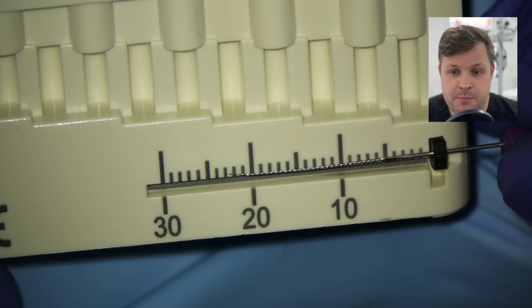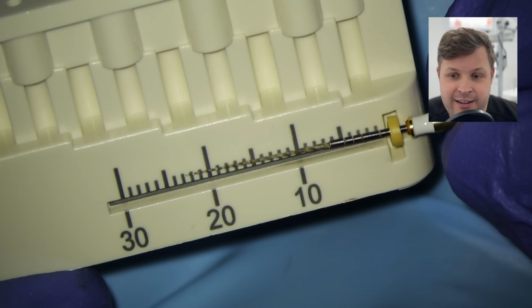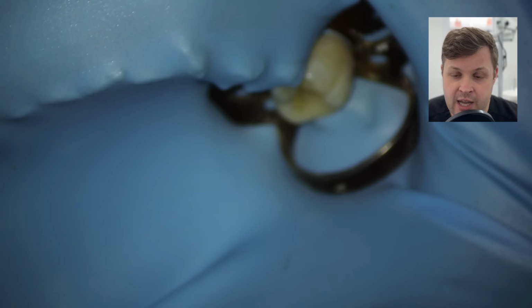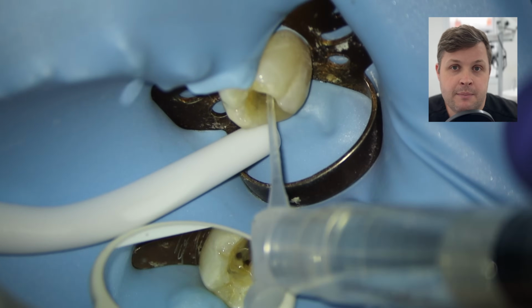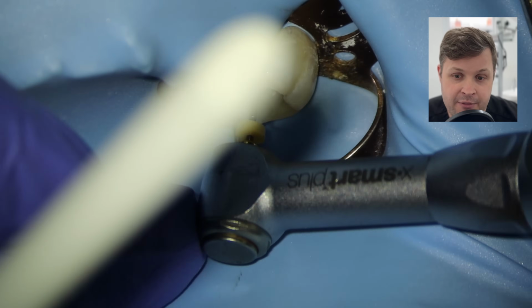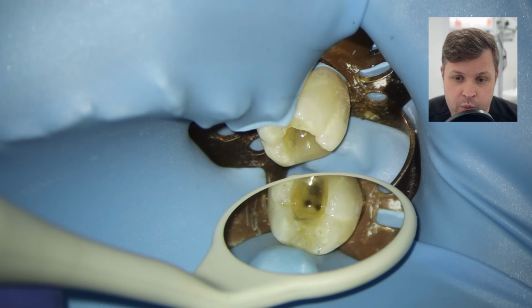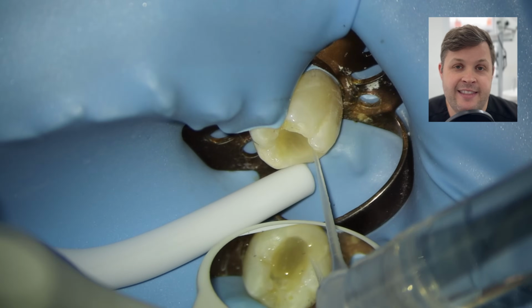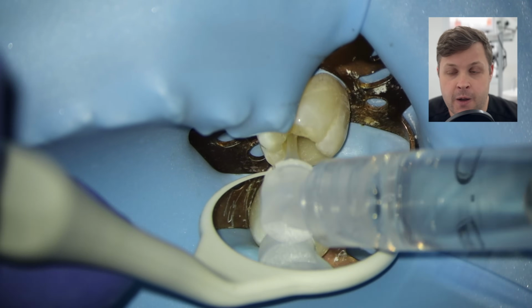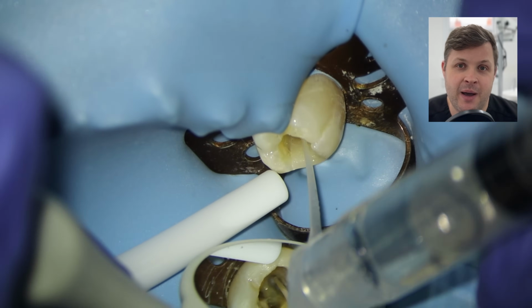So it's at this point we know that we've shaped this mesiolingual canal at the very least up to this point. So we're going to use our glide path file again at 23. We're going to use our master apical file, our 25 variable HyFlex, again up to 23. And there we have it. We've got two joining canals in the mesial root, and they've both been shaped and they're all ready to go. And now we're ready to negotiate and shape our distal canal.